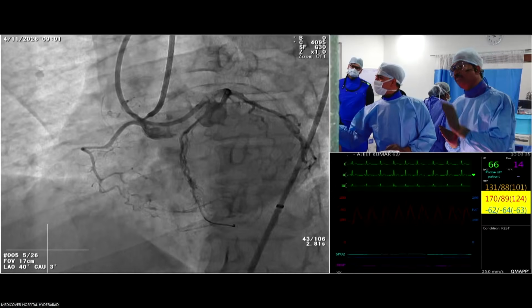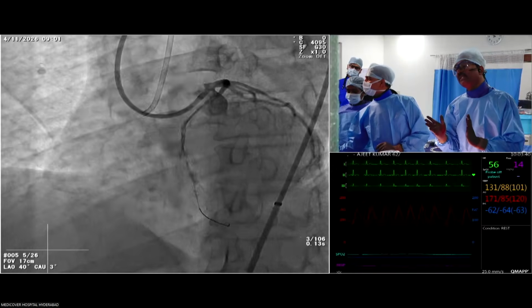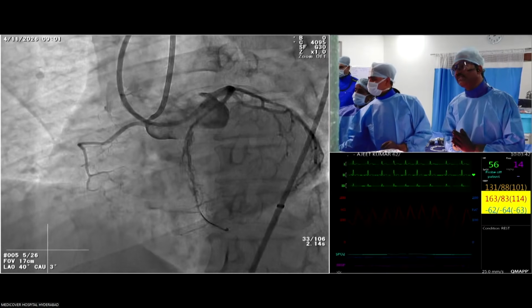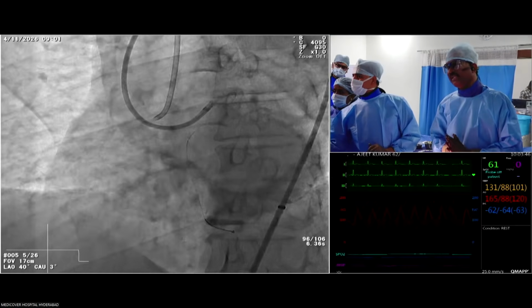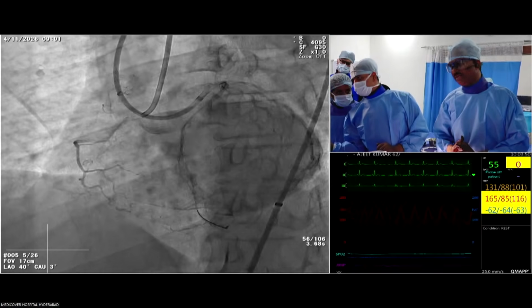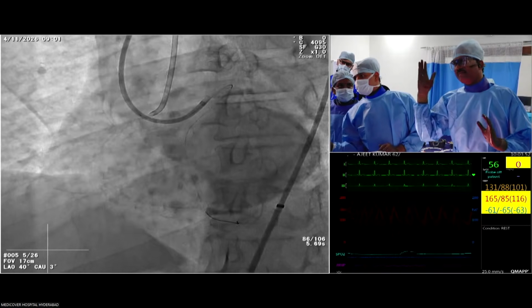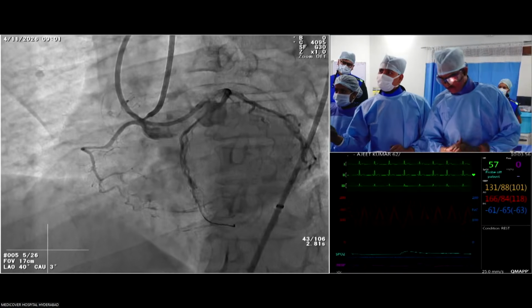But the second, concerning point is the distal vessel visibility. You can see this is a dual injection, so the distal vessel is hardly visible. In such visibility, it is really difficult angiographically to understand where your wire is. And that is a clear point for me to go primary retrograde in this case.